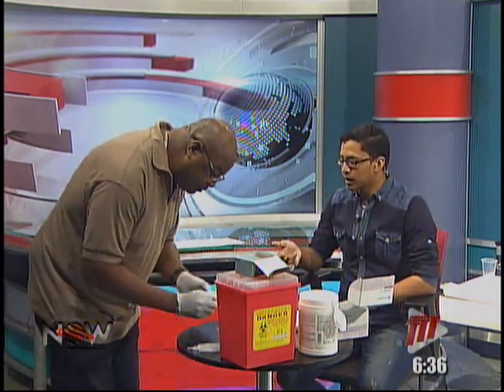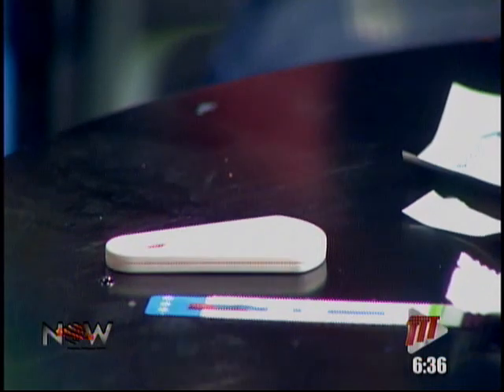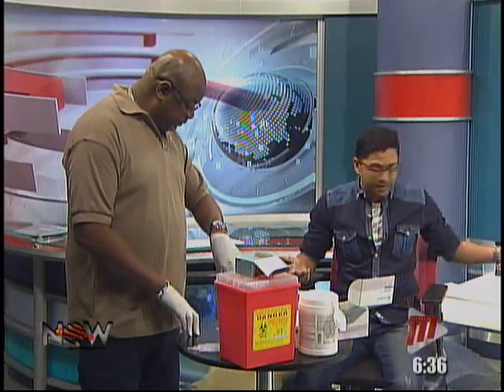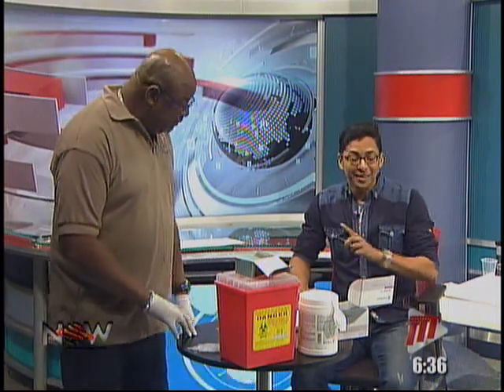And everybody who is sexually active should get tested. Exactly, because it can affect them. Yes, it really can. So, and that is it? We just wait for 15 minutes, and then we'll find out what's going on. Exactly. Good or bad, we'll see what happens.